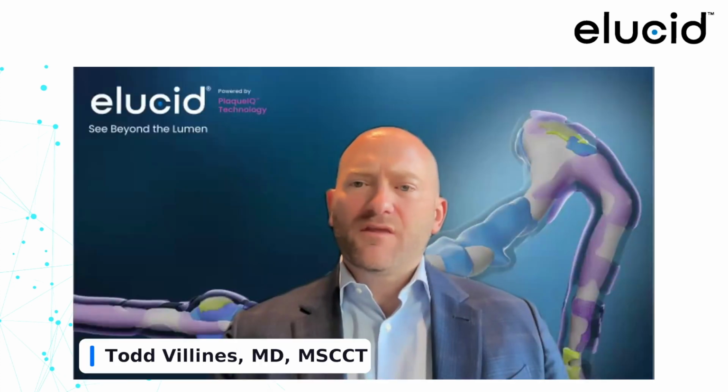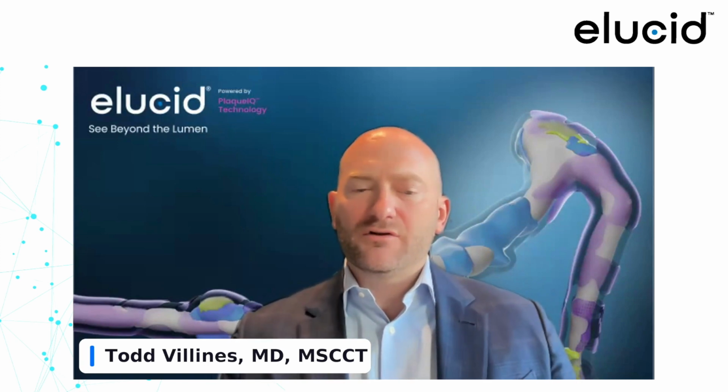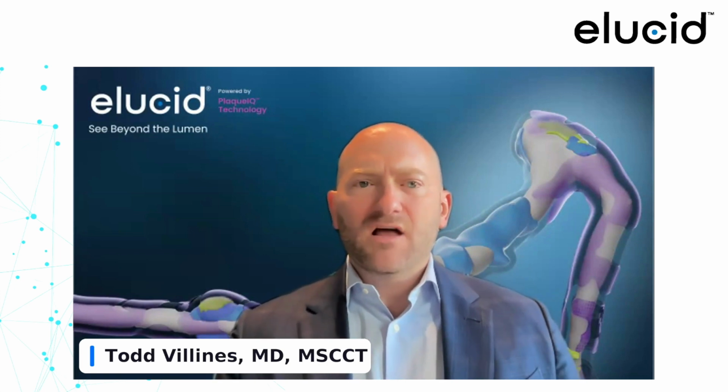Great. A quick question. One of the things that we have seen in the 2021 guidelines was this new definition of coronary disease, right? That coronary disease is now defined based on plaque on CT, not according to the traditional criteria of needing stenosis above a certain threshold or having prior MI or revascularization. So maybe Lance, and maybe at the Mayo Clinic with Eric, how are you following up these patients? You're doing more and more CT scans. We're seeing more and more plaque, and we even have the ability to do advanced plaque quantification. But how are you pairing what you're seeing on CT with following up these patients, ensuring optimized prevention? I know this is a challenge for a lot of practices, but an opportunity, in my opinion, to drive better care.